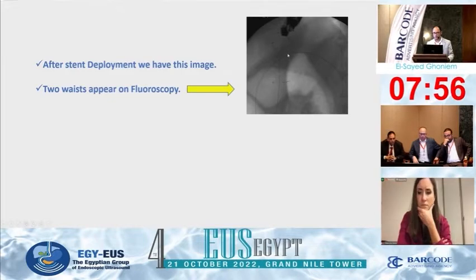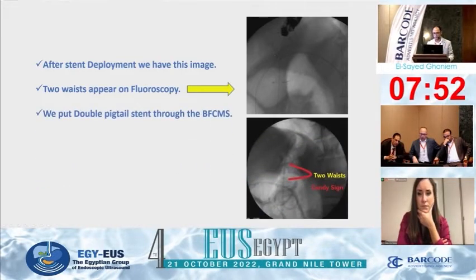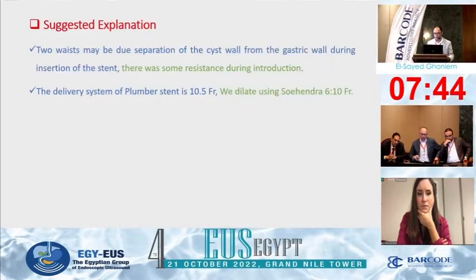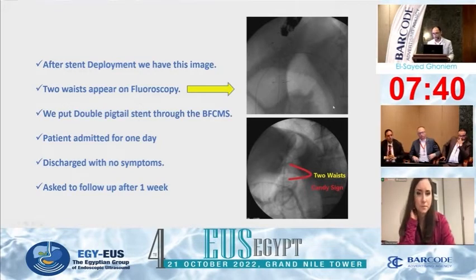This here, two waists. I have another photo. I put a pigtail here. And the patient was admitted for 1 day and discharged with no symptoms on the second day. We asked him to follow up after one week. Here, it's clear, Dr. Hussein. This is two waists here and here. Yeah, very clear, very clear.